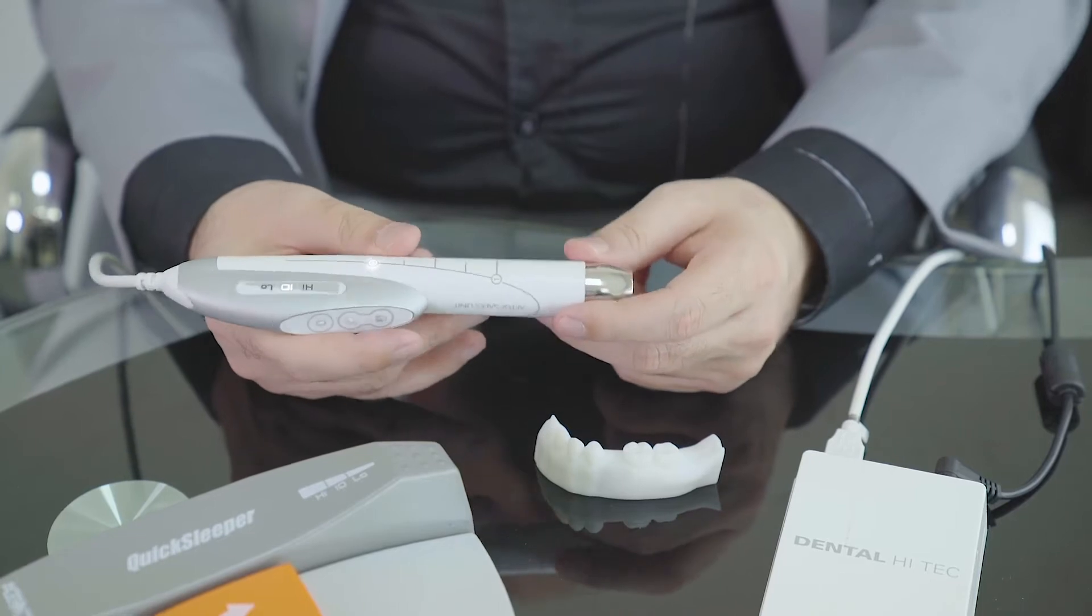Hello everyone, today I will demonstrate Quick Sleeper and focus on intraosseous technique from A to Z, for sure on the model. Let's see the simplicity and how to do efficient anesthesia inside the bone.